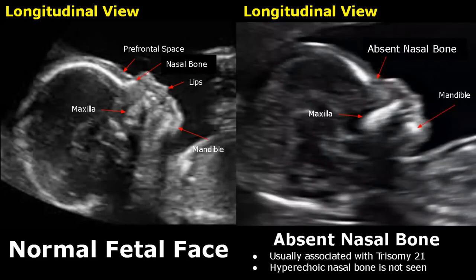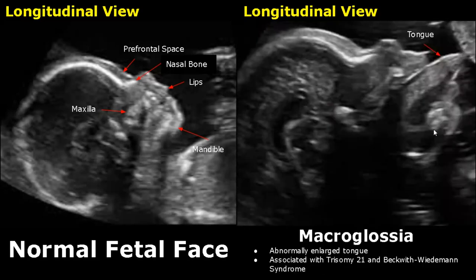Absent nasal bone is usually associated with Trisomy 21. The hyperechoic nasal bone is not seen in the abnormal image, whereas in the normal image we can see the hyperechoic nasal bone clearly. Macroglossia refers to an abnormally enlarged tongue, and it is associated with Trisomy 21 and Beckwith-Wiedemann syndrome.